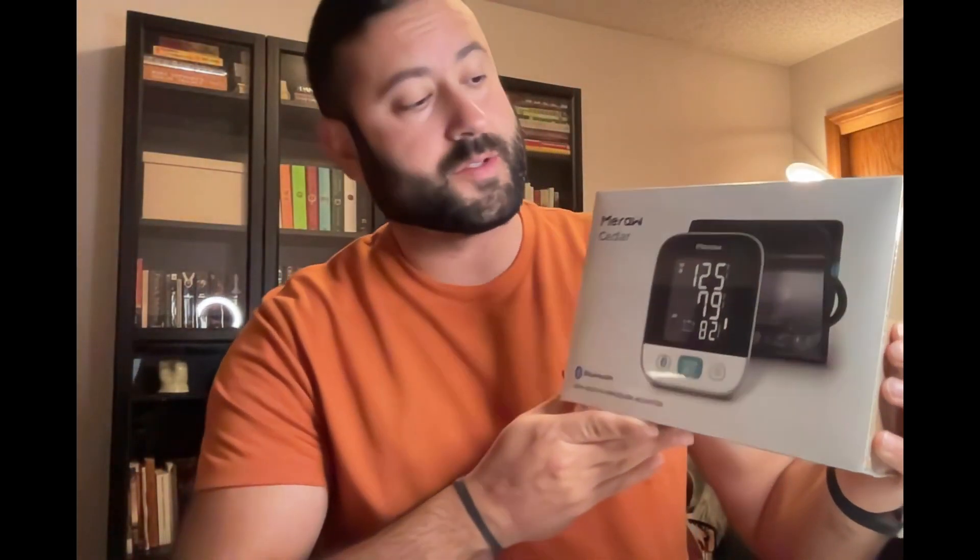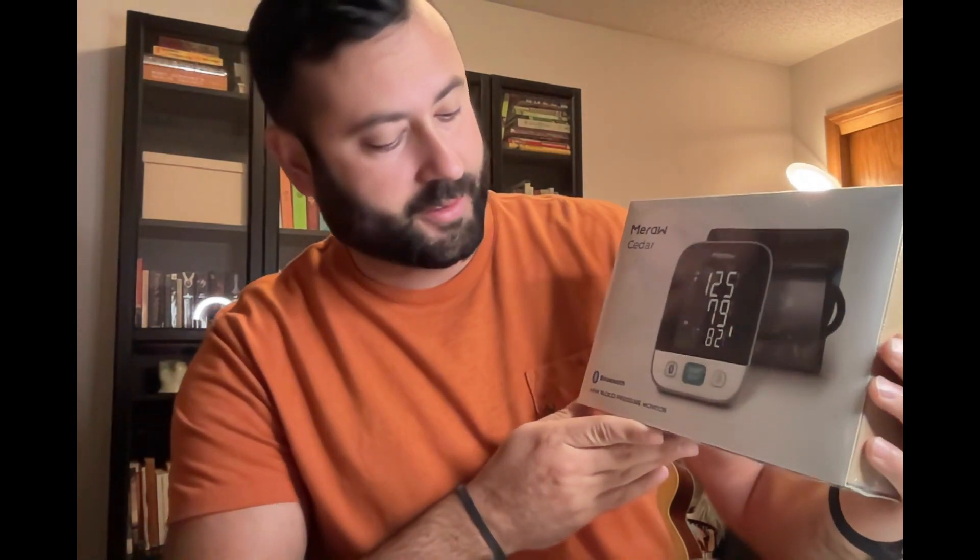Hey everyone, I just wanted to go over a quick unboxing of this Meraw Cedar arm blood pressure monitor.